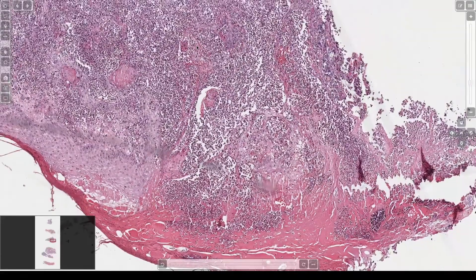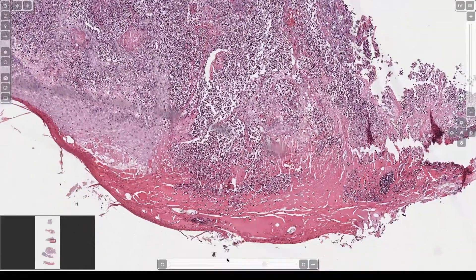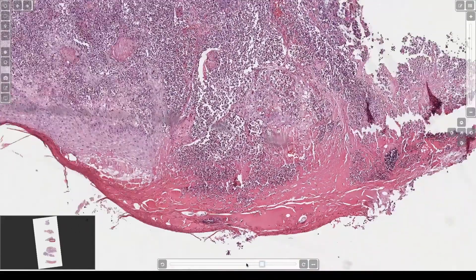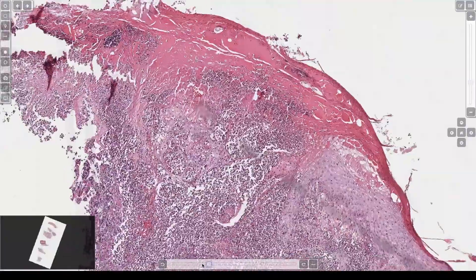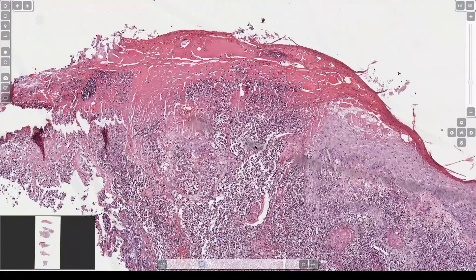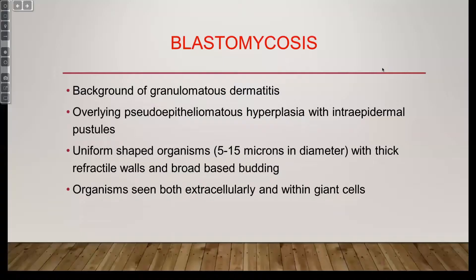Plasma cells are a nice clue. The presence of epidermal hyperplasia — that pseudoepitheliomatous hyperplasia pattern with neutrophils and granulomas — also really strongly makes you think of deep fungal infections, among other types of infectious things. So that's blastomycosis.